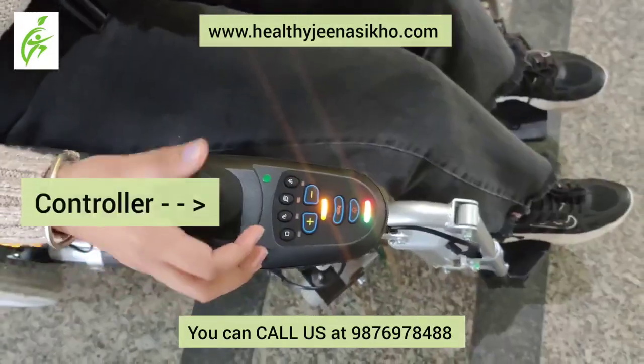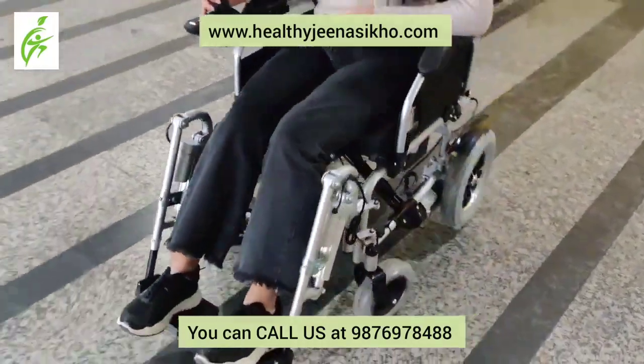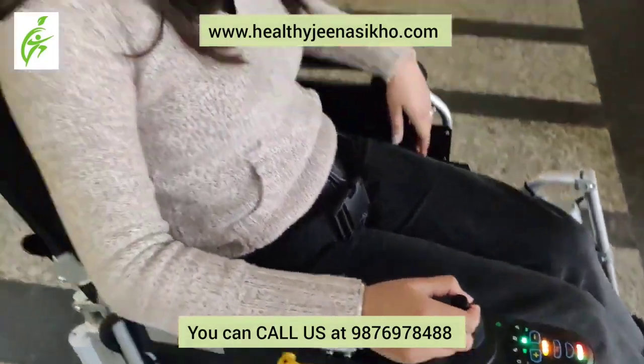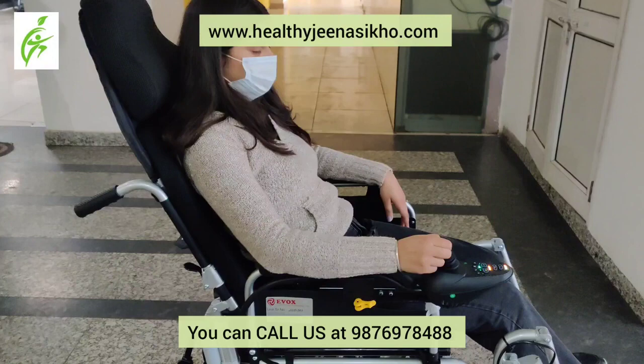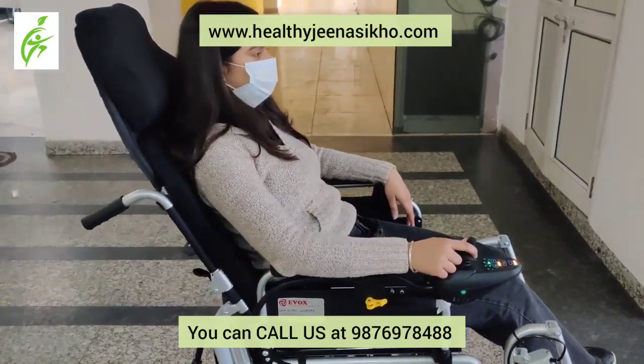It is remote controlled. You can put it on both sides — Left P and Right P. You can move it with joysticks on both sides. You can also recline the wheelchair, as you can see.